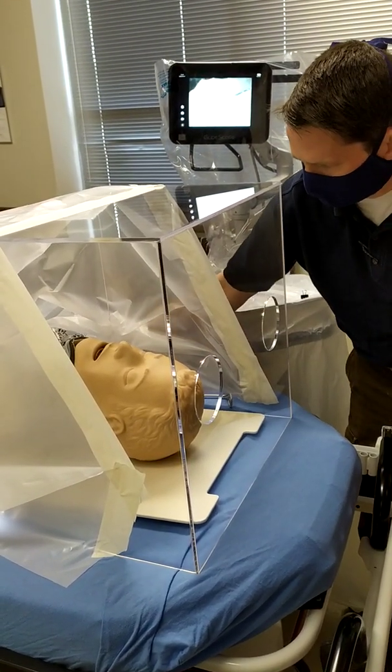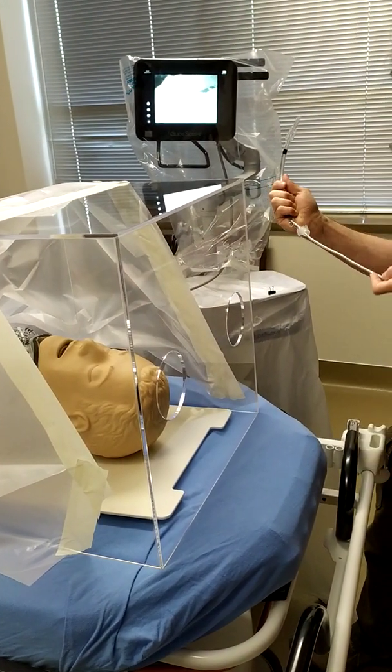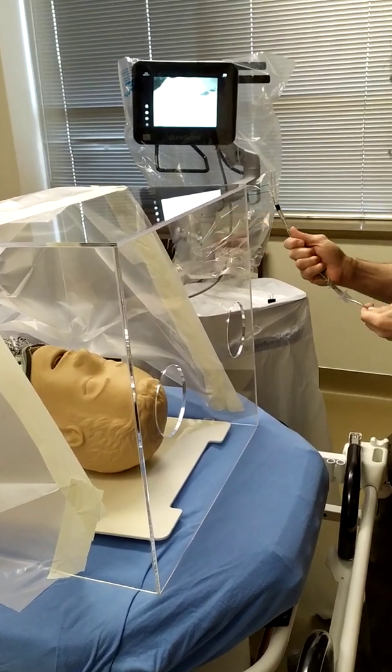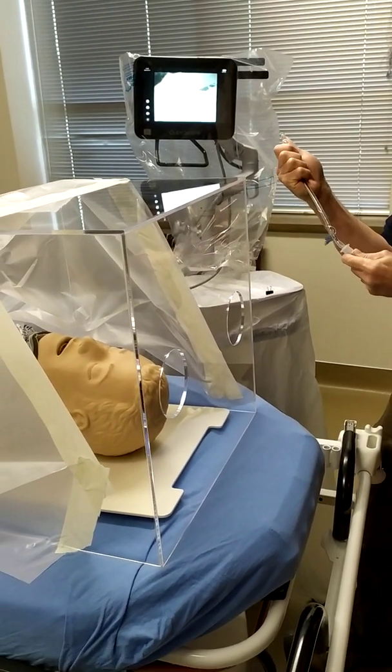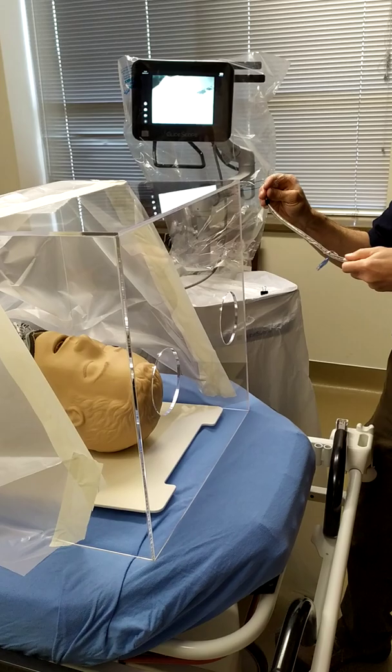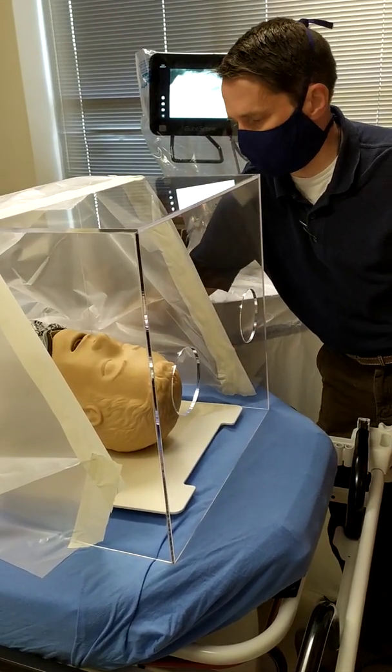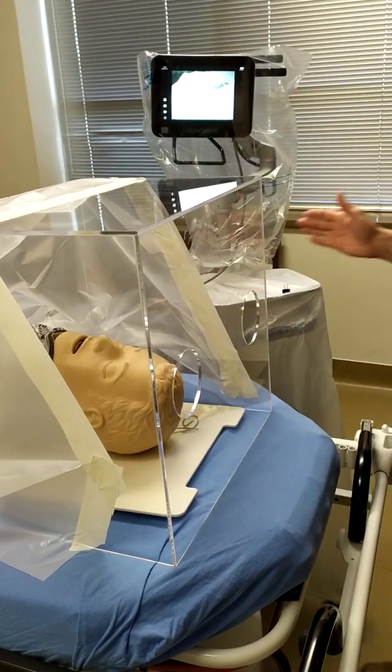You're also going to place your equipment that you're going to need. We're using a regular stylet on this. You do have a standard there also in your plastic bag. We're going to work with this one just so we can get used to it if we don't have a stylet. And you slide all these pieces of equipment in there. So you've got this all set up for your intubation.